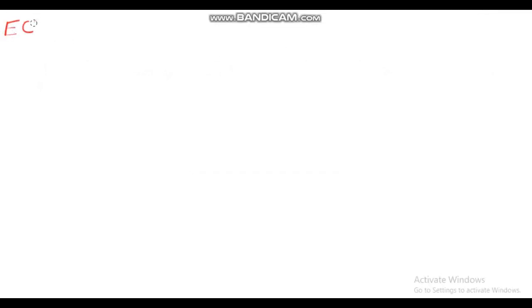Hello guys, today we'll learn about ECG, the basics of the leads. The ECG actually tells you about the electrical activity of the heart, which is recorded on paper with a speed of 25 millimeters per second.